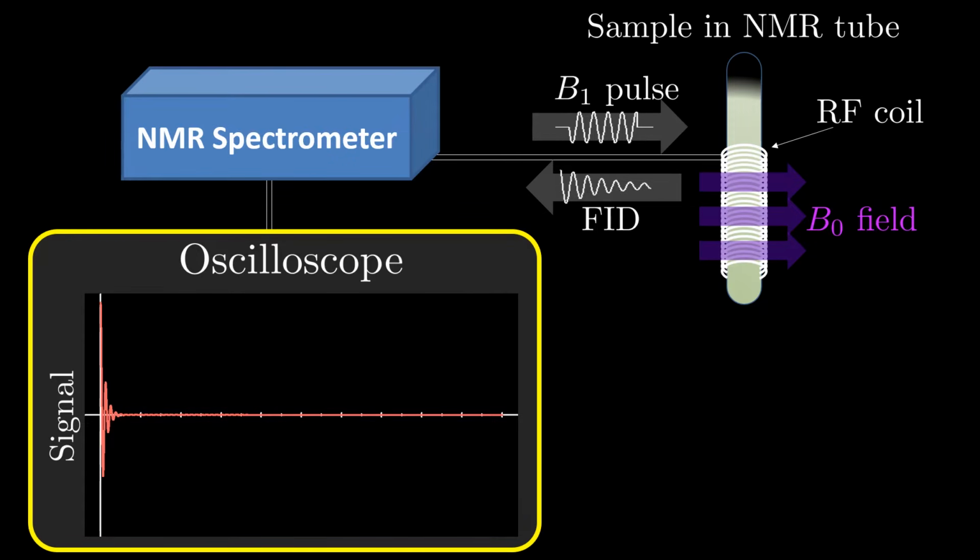Well, it actually turns out there's an assumption we've made throughout our tour of NMR which is now being challenged. Our B0 field isn't perfectly homogeneous. We've assumed that B0 at every point in space is exactly the B0 field strength in the z direction. But of course no field is so perfect, and even slight variations in the field strength and direction can have a substantial effect on our NMR experiments.